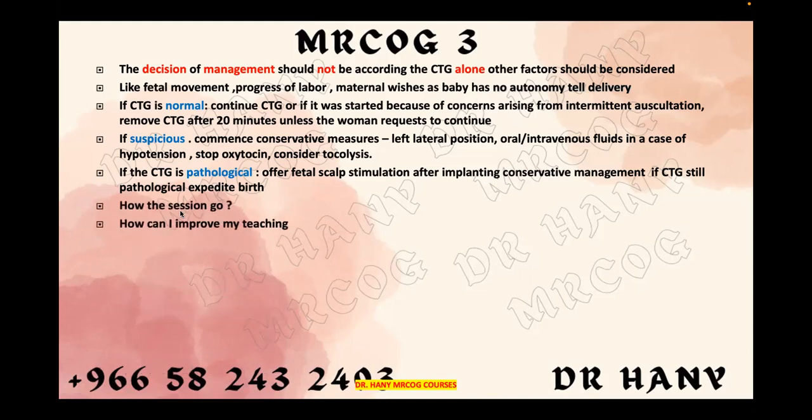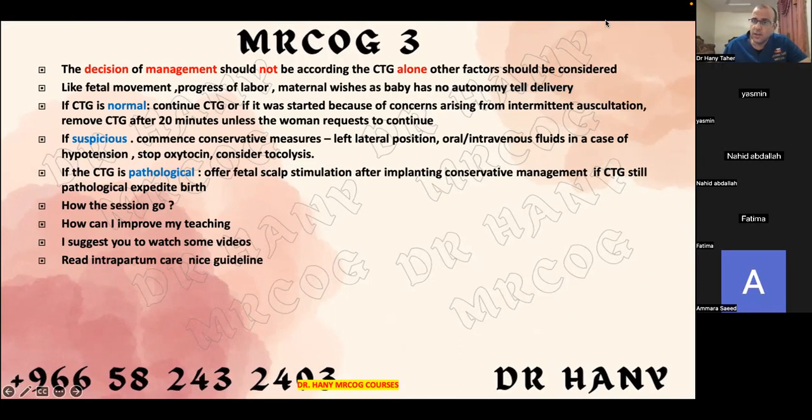This will apply whether you are given a normal CTG, a pathological CTG or a suspicious CTG. So you need to address what is in front of you. Is it normal? Is it suspicious? Or is it pathological?